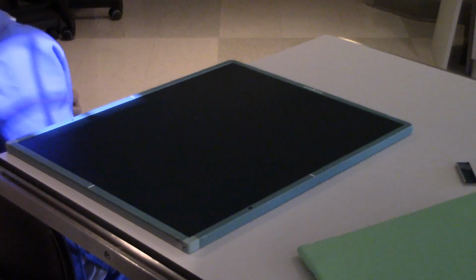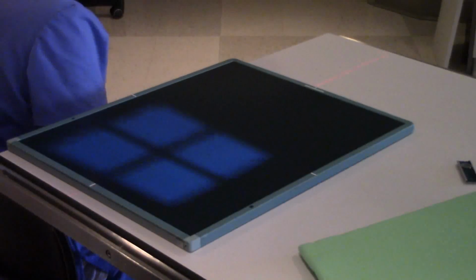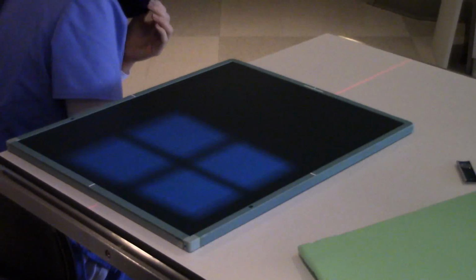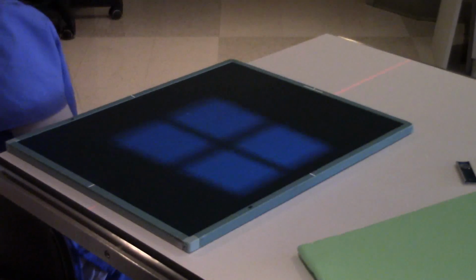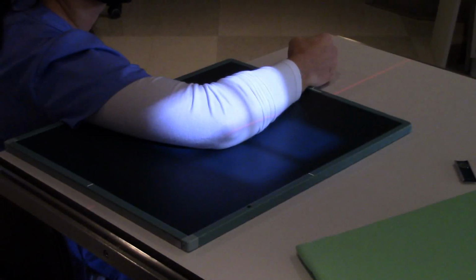Gosh, how far do I have to go back? I don't know, but you're about to whack me with this high voltage cable. Ow! Okay, that was really far. Okay.